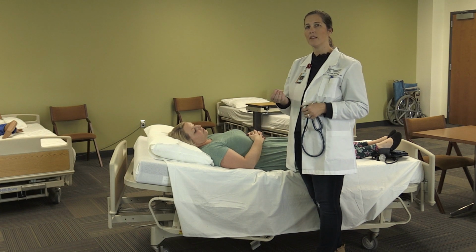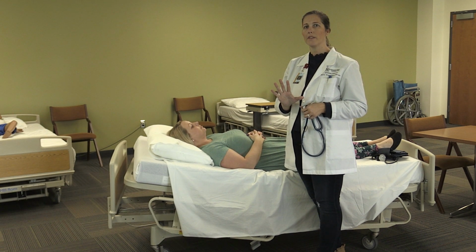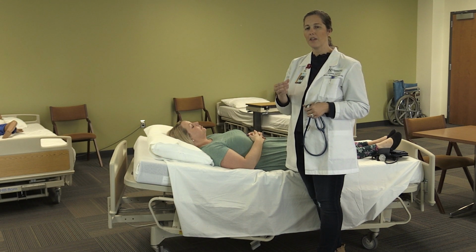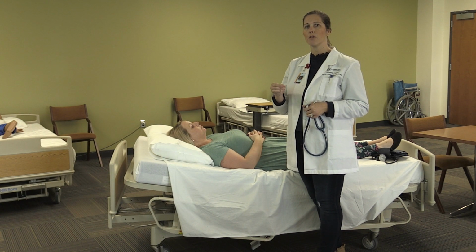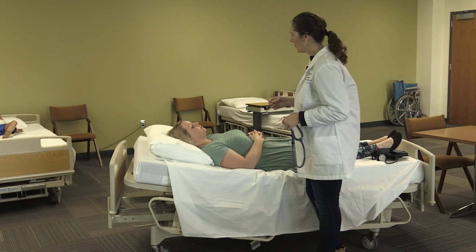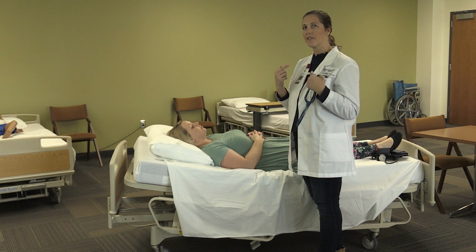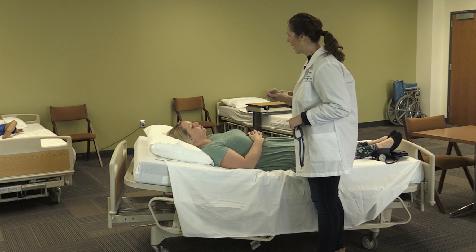When you listen and do a cardiac assessment, there are 5 landmarks that you want to identify and listen over. And I use the mnemonic, all patients enjoy taking meds, as a reminder to help me remember the landmarks. So let's go through those now. The 2nd intercostal space on each side of the sternum is the aortic and the pulmonic.